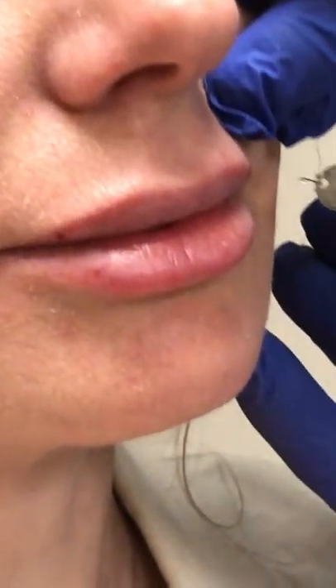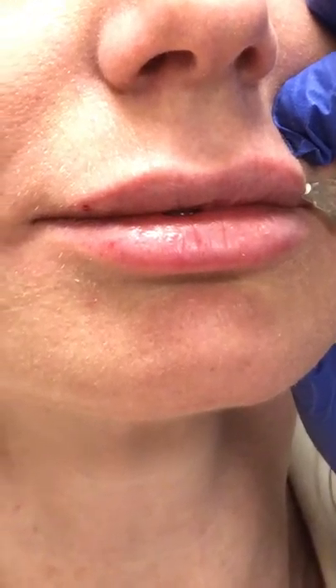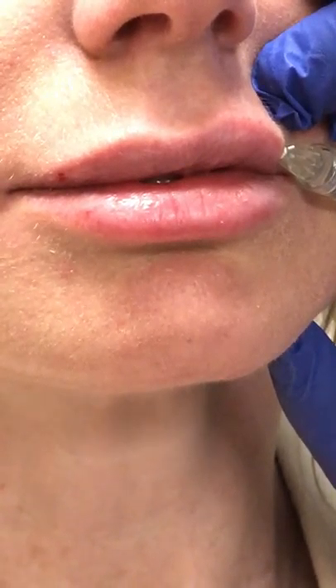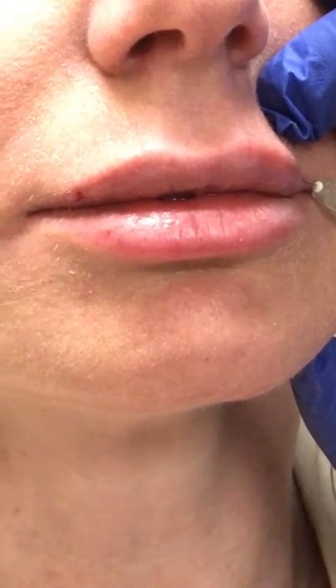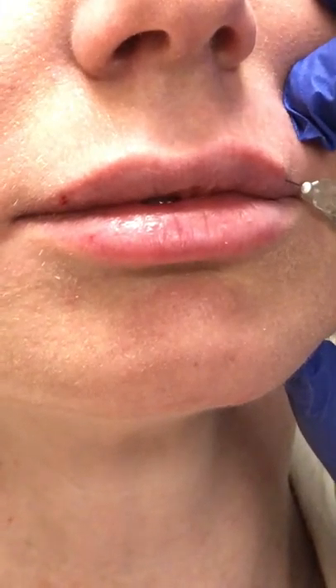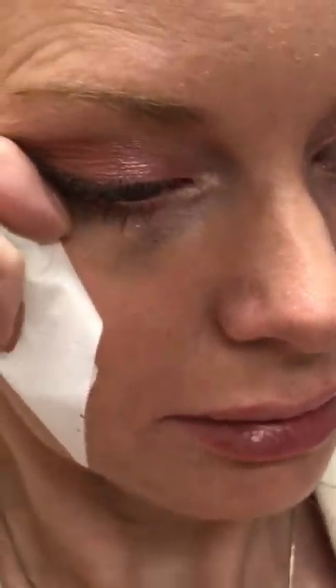Let's add a little more — little pinch. Coming over to this side, a little pinch. Take a look right here — that's just with a little bit of volume in the upper, and it accentuates that line there. I love it.